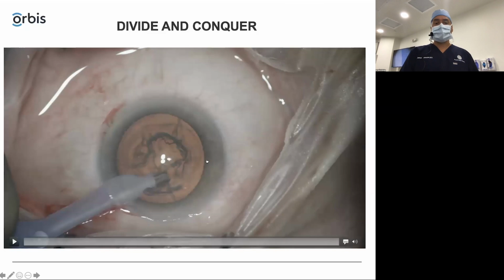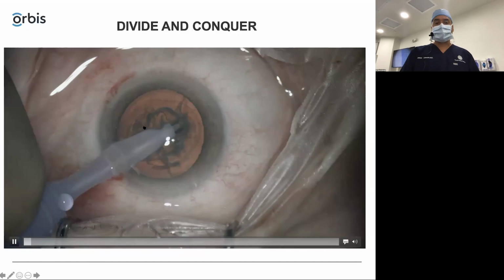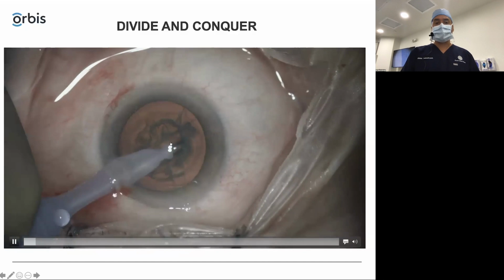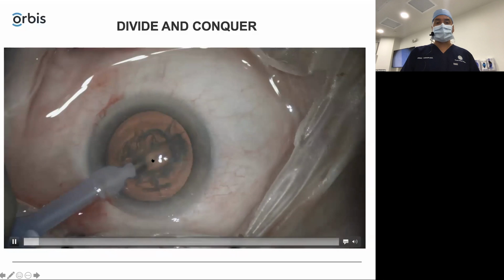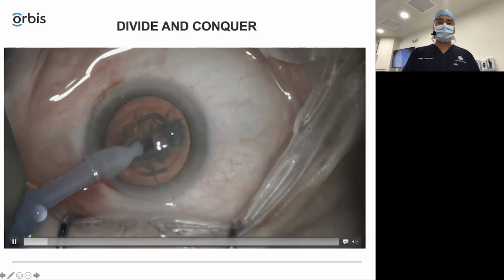And then the divide and conquer technique is basically to remove a little of the nucleus here in the center so you have a good view, and then using the sculpt mode in the phaco machine, you create a tunnel. I mean, like a little crevice here in the middle of it.